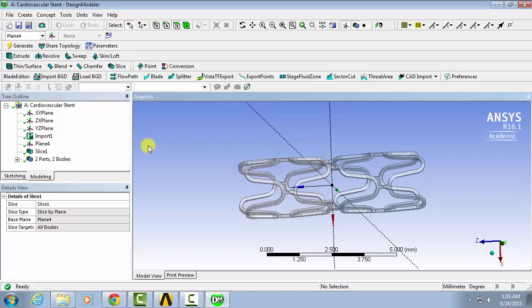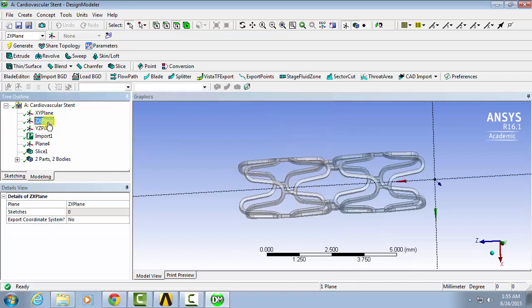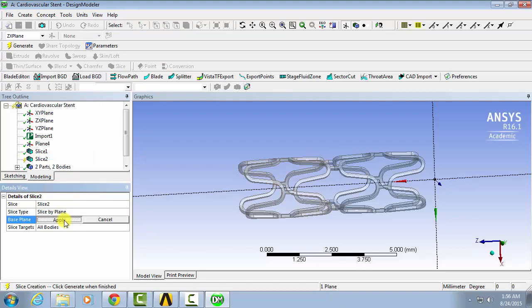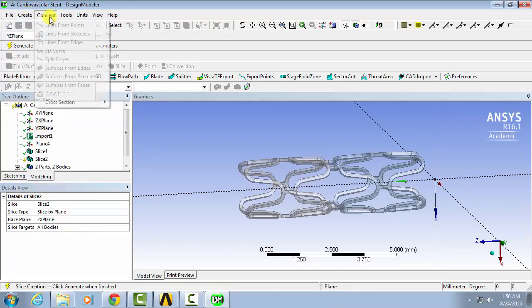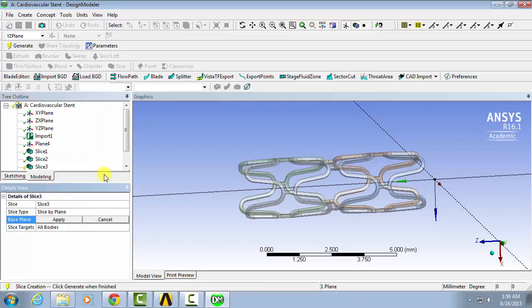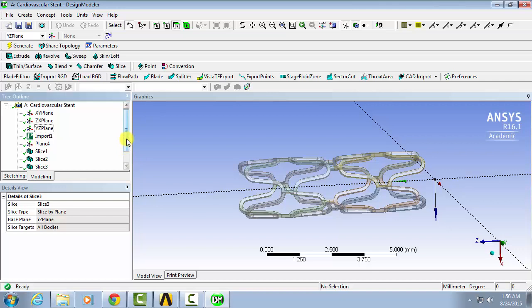Similarly, we're also going to cut by the ZX plane and the YZ plane to get the other quadrants of symmetry. So you can select those, create, slice, apply, and then generate first, and then select the other plane, create, slice, apply, then generate. So now we'll have 8 bodies, 8 parts.